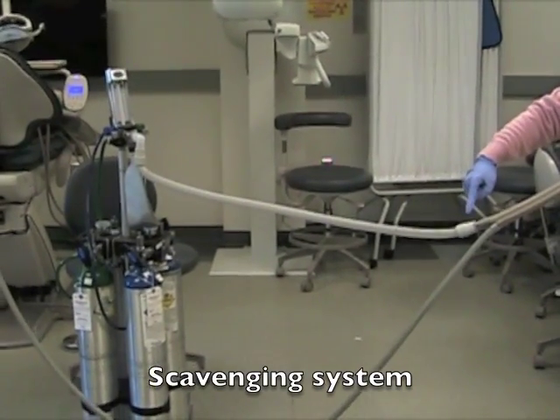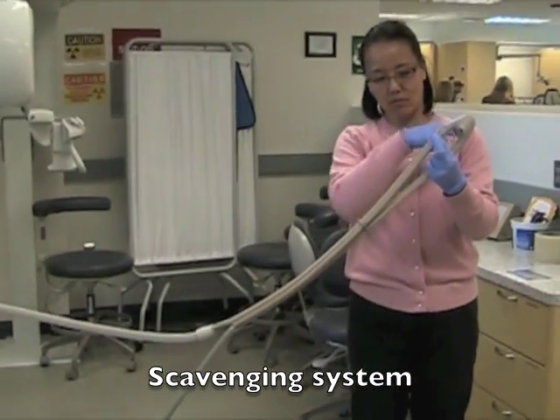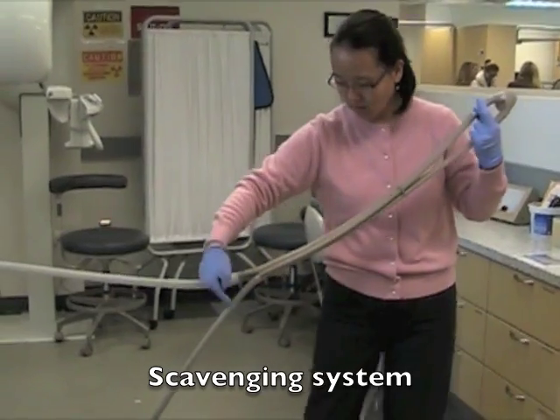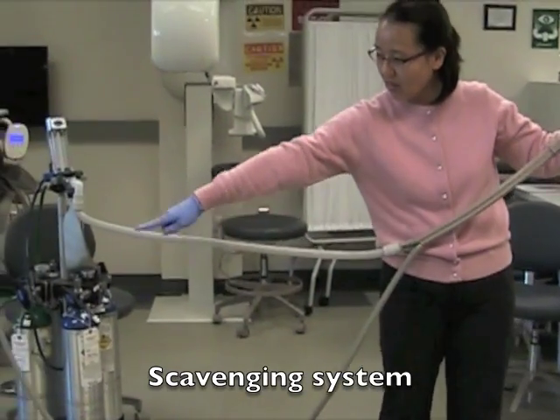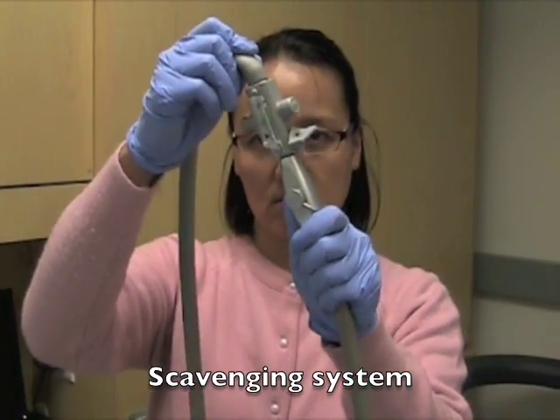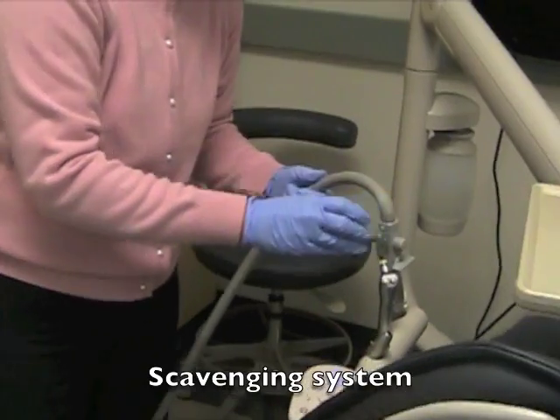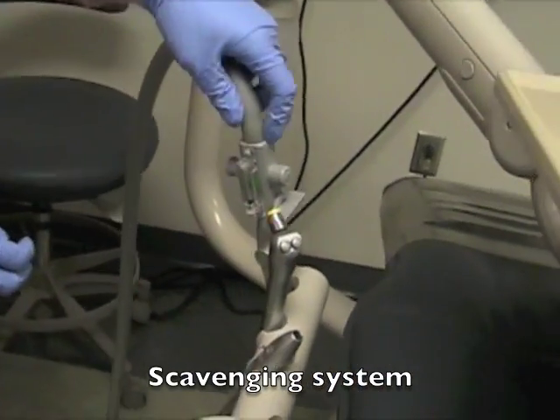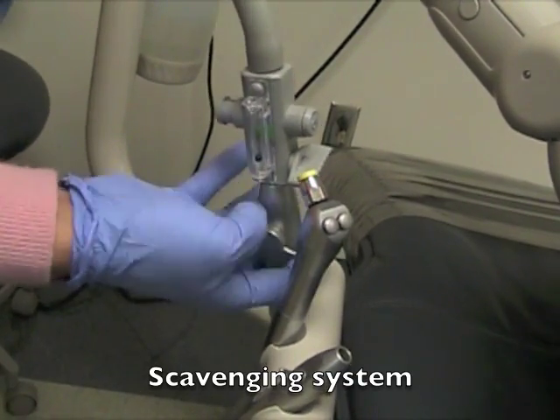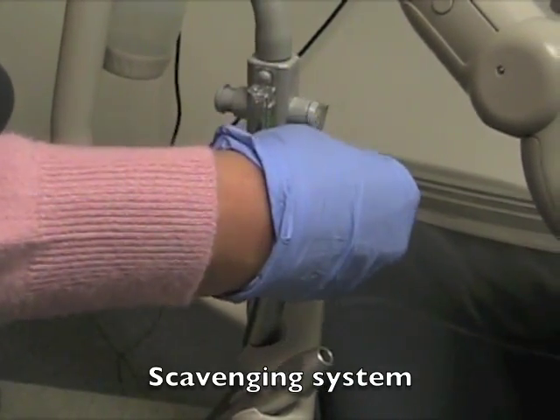This is the scavenging system. Both nitrous and oxygen gas come in and go through the nasal hood. The exhaled gas is suctioned by a small tube which is attached to a slow suction — the scavenging system connects to high speed suction. Then airflow is adjusted by the knobs. Make sure the black ball stays in the middle of the green section.